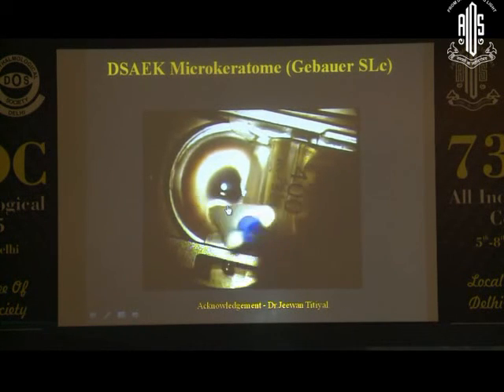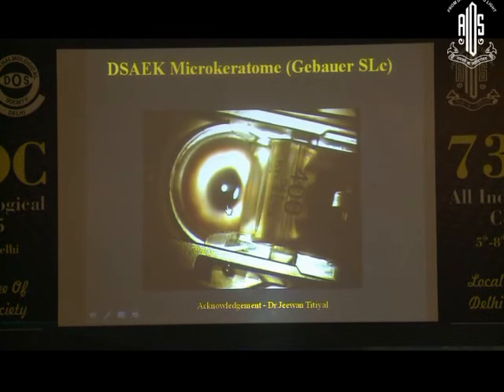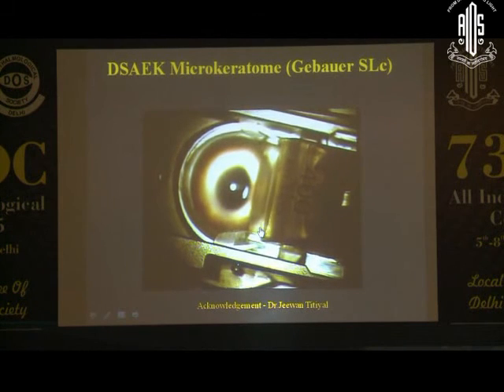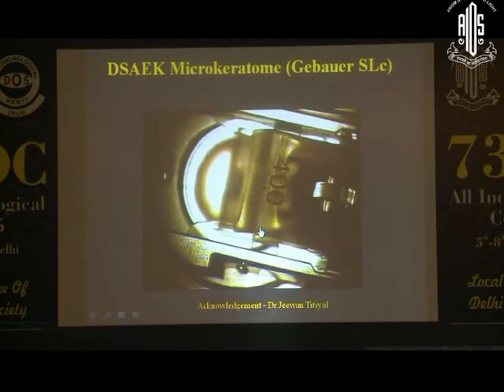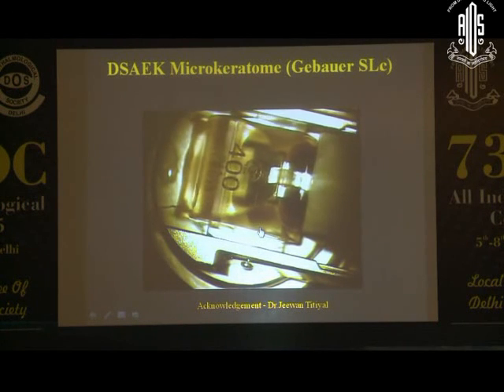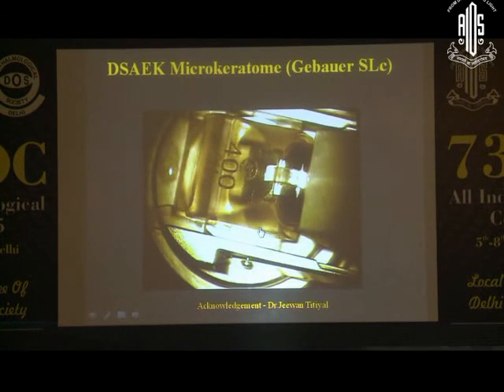The epithelium is debrided, and a slow, the surgeon checks the tautness of the globe, and then the dissection is carried out. The pass should typically last 10 to 12 seconds. A slow uniform pass is important to get a good uniform cut.